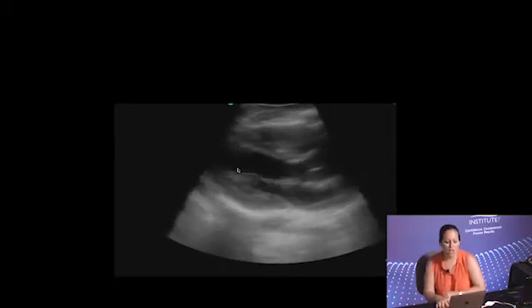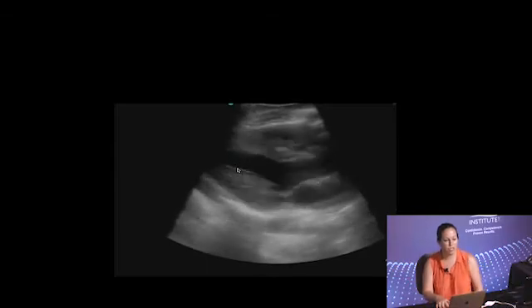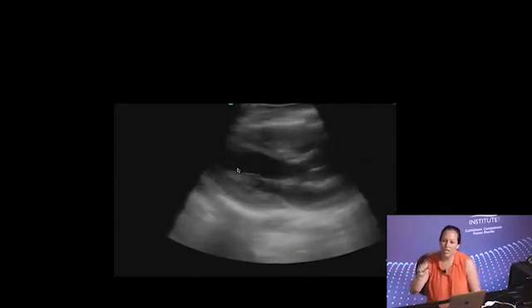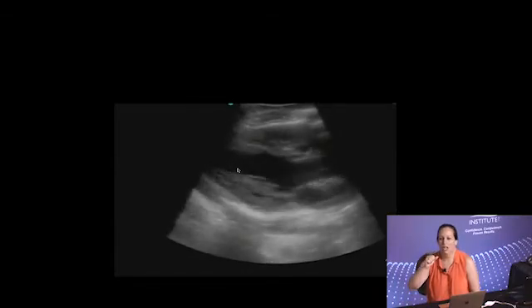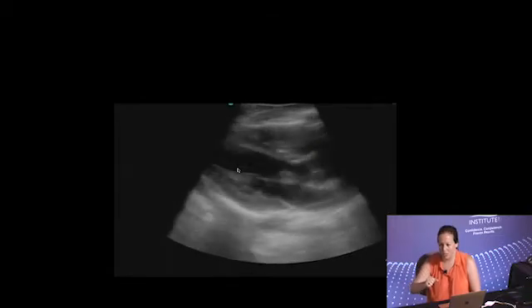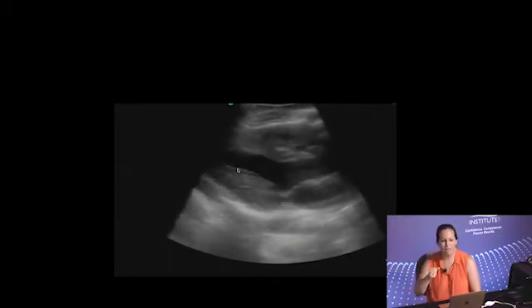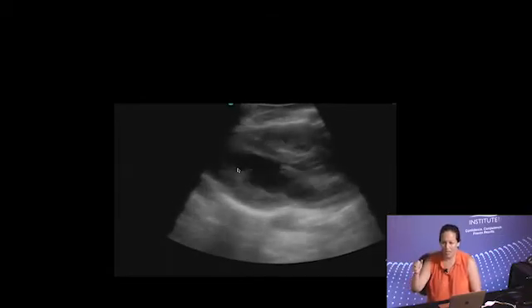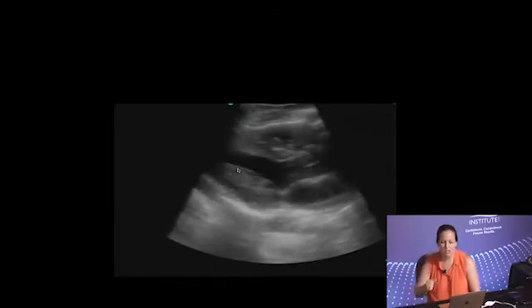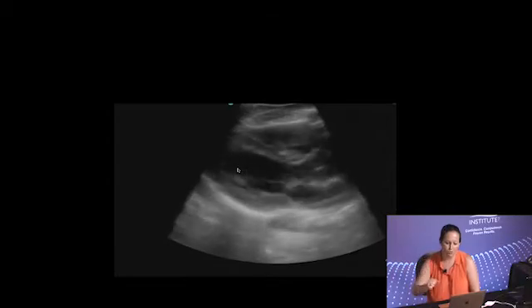Okay, so parasternal long axis, we're going to start off easy. We're just going to focus on contractility. There are two components: you have contractility, and then you also have kind of rate, right? Contractility, good squeeze or bad squeeze, those are your two options. And then if it's fast or slow, hyperkinetic, hypokinetic, and then normal in the middle. So those are the three options, and contractility is either really good or really bad.